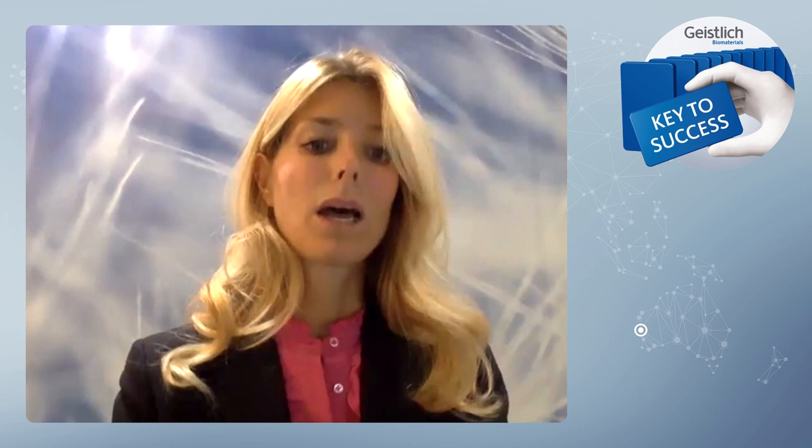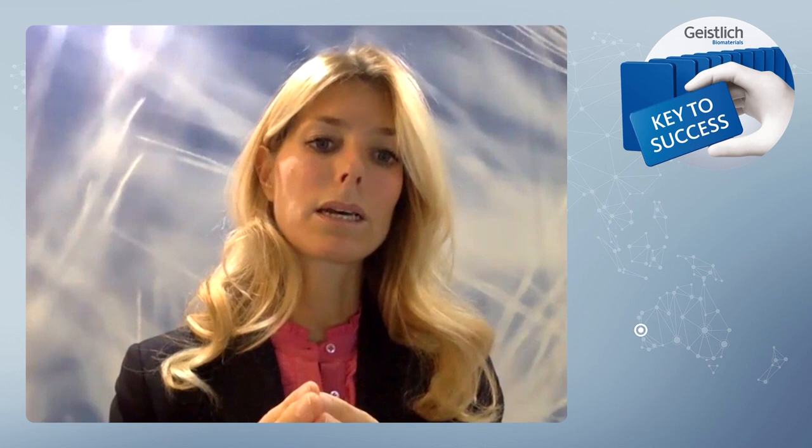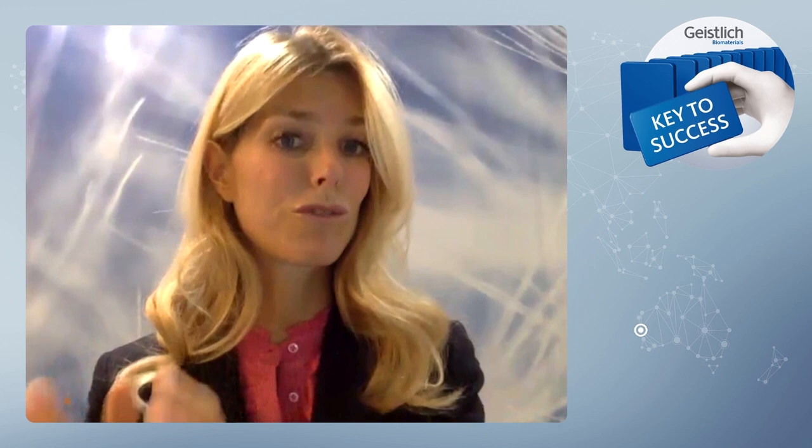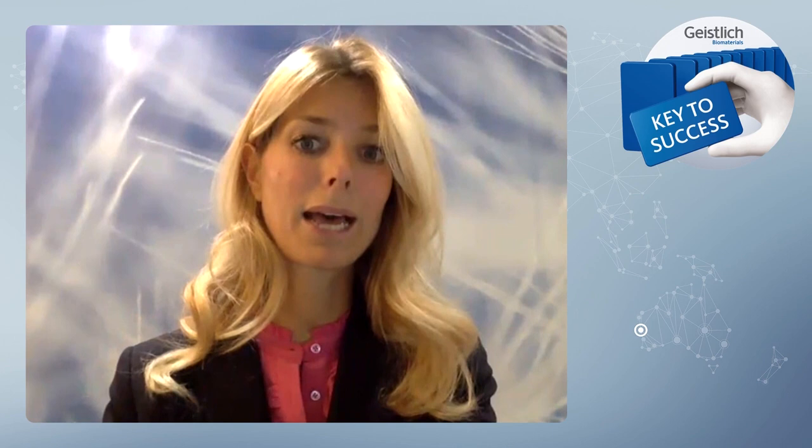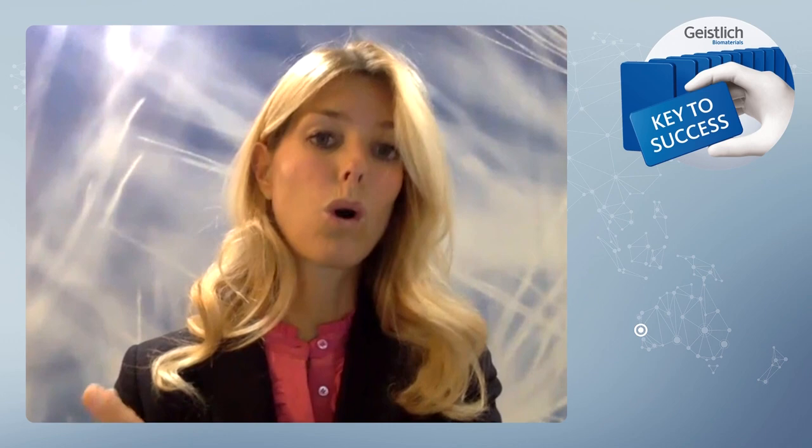So in fact, following also the Swiss experience, Ronnie Young and we have discussed this together, the protocol is to remove the tooth, do absolutely nothing, to be able to intervene very rapidly. 6 weeks later, you're only waiting for the soft tissue closure, and at that point, with your CBCT scan, you have the bone, which is a virgin bone, and you can then plan your implant in the right position, if you have enough for primary stability, with or without GBR, or GBR alone, and then the implant.